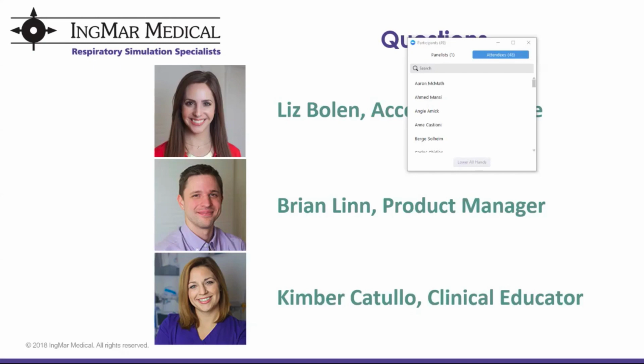To add a little to that, Carlos, you also have the ability to control the patient's effort, like Brian said, but the degree of it as well. So if you want them to actually fail the breathing trial but still make efforts or a weak effort, that is possible as well, to give that experience to your students.